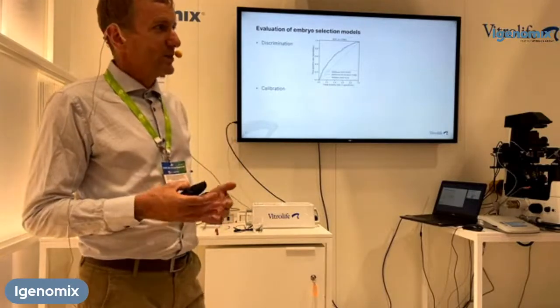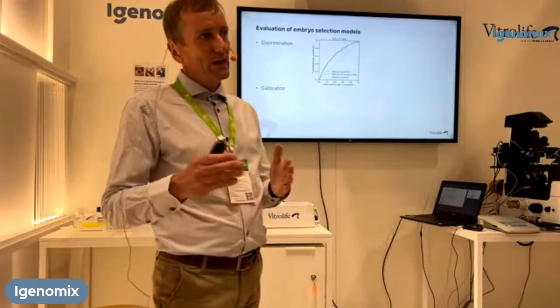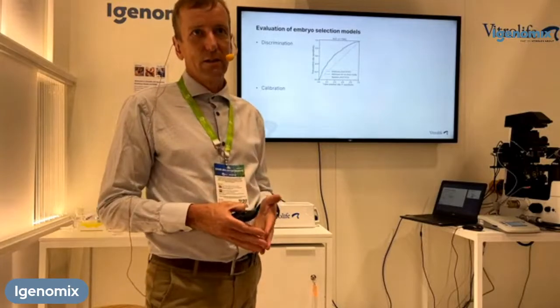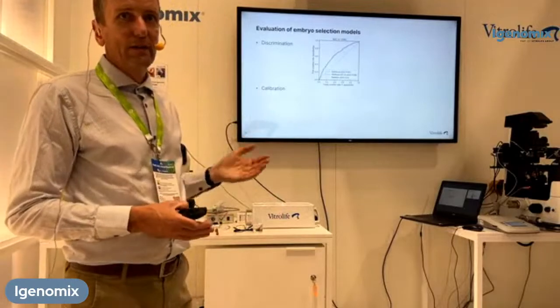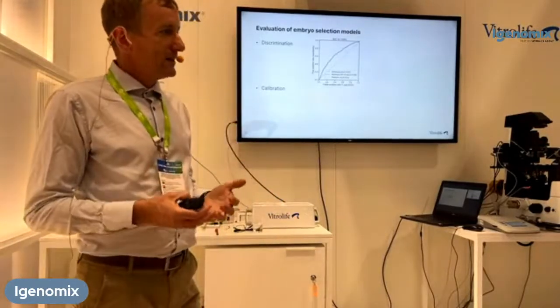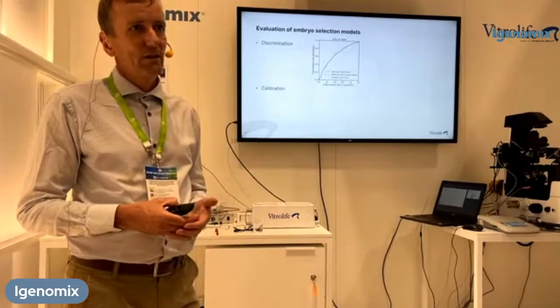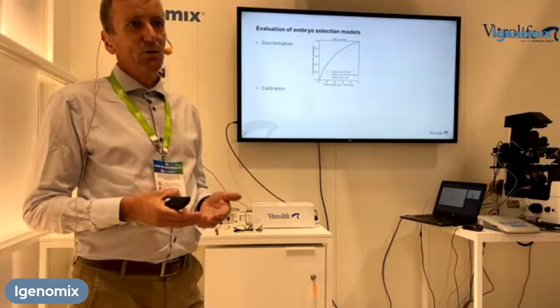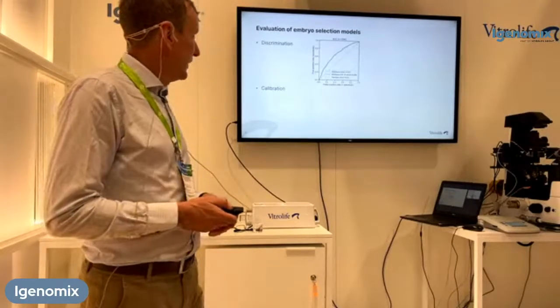As you might know, it is a model that depends on the embryologist doing annotations of several morphokinetic events and also scoring the blastocyst. What we found was that iDAScore was slightly better than the manual annotation. So basically that tells you that the AI is performing at least as well as an embryologist, but without the need to do the manual annotations that are required for the other model.